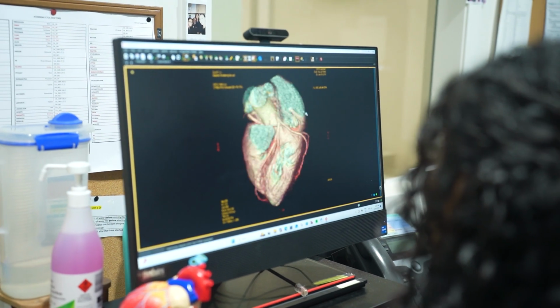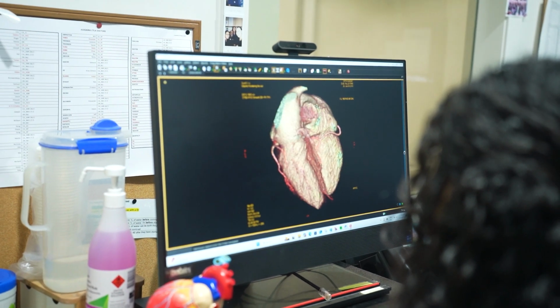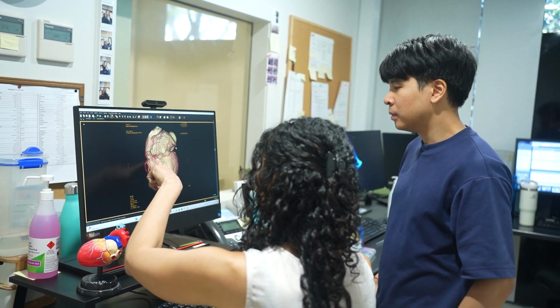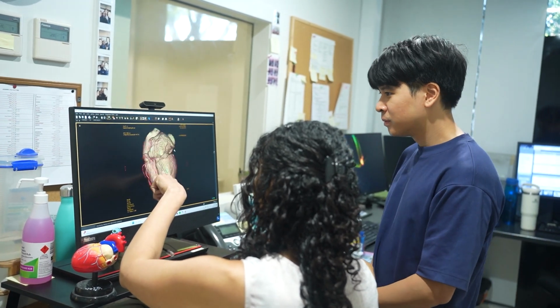Once your doctor has the results from your scan, they will have a better idea as to whether your symptoms are due to coronary artery disease. The images will also give an indication of the burden of disease, which has a direct relationship with prognosis. The main arteries of the heart can be isolated and viewed from different angles, which will highlight the severity of individual plaque lesions as well as the plaque characteristics. Some are more favorable than others.